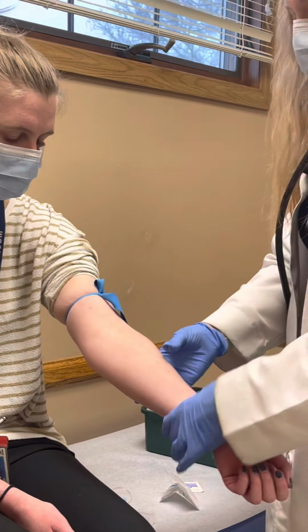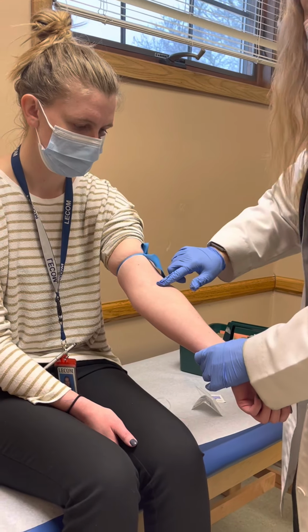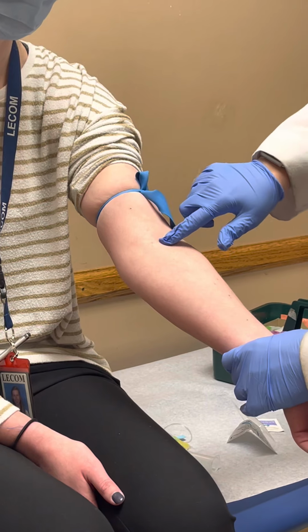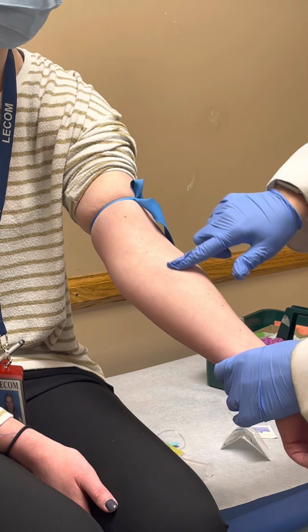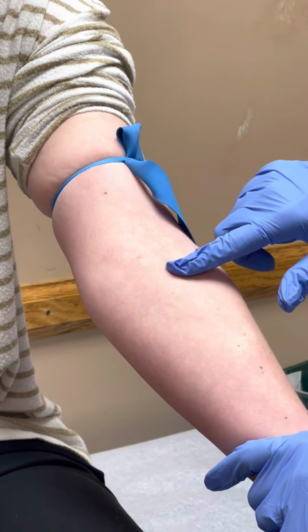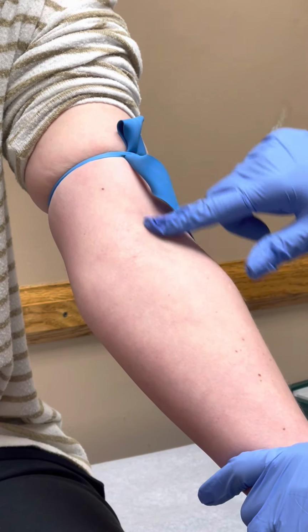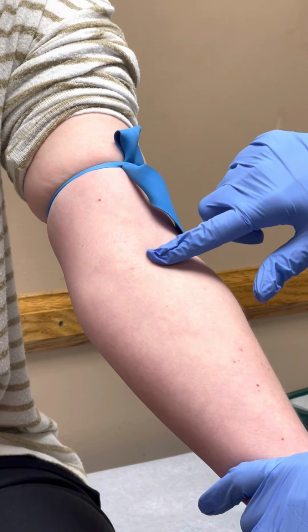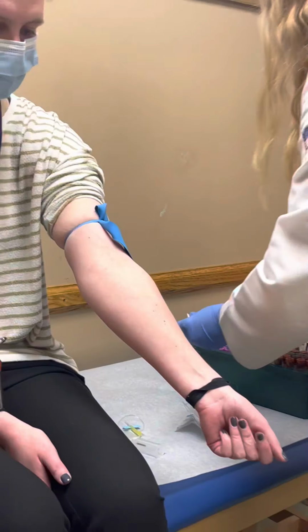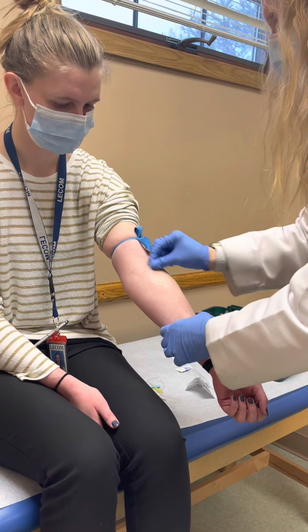Okay? The next thing you're going to do is palpate for the vein. When you palpate for the vein, you're going to feel something that feels like a worm or like a piece of spaghetti, like al dente spaghetti. And of course she has one tiny little baby vein right here. I don't know if you guys can see that. So it's not necessarily what you see, it's what you feel. Just because you might not see anything, but you palpate and feel this vein, like you can't really see that vein very well, but when I feel it, you can feel that it's kind of springing back at us. So next thing we want to do is clean the area really well with rubbing alcohol.